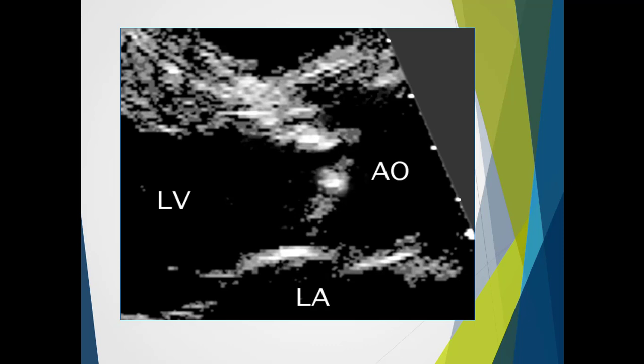And here we have an example of a stenotic aortic valve taken from the parasternal long axis view. To measure our left ventricular outflow tract diameter, we want to take the insertion point that comes in here with the right coronary cusp, and then assuming this is the non-coronary cusp, the insertion point here. So our true diameter is here to here.